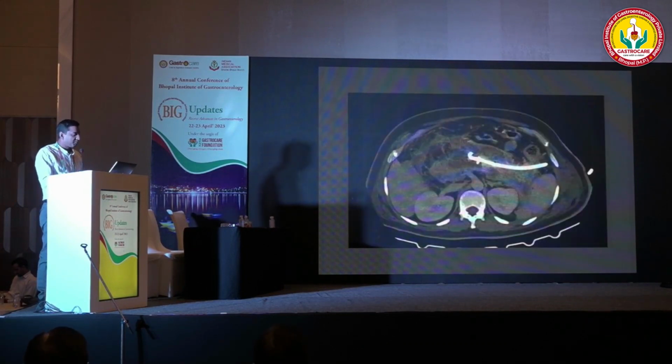This is another patient with a large peripancreatic collection. The patient had fever and sepsis, so we had to put a drain. If you see this drain, we put it posterior to the descending colon. Basically, this is a retroperitoneal drain, and if the patient's condition doesn't improve or further deteriorates, this tract can be used for video endoscopy assisted necrosectomy, or even for laparoscopy assisted necrosectomy as well.